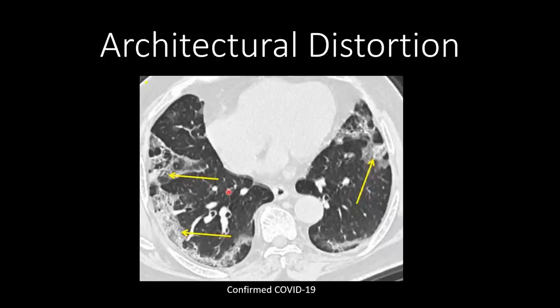This is another case of severe COVID pneumonia. We start to see more architectural distortion — the lung almost looks tethered or being pulled. We start to see more linear opacities in addition to the areas of consolidation and ground glass opacification.